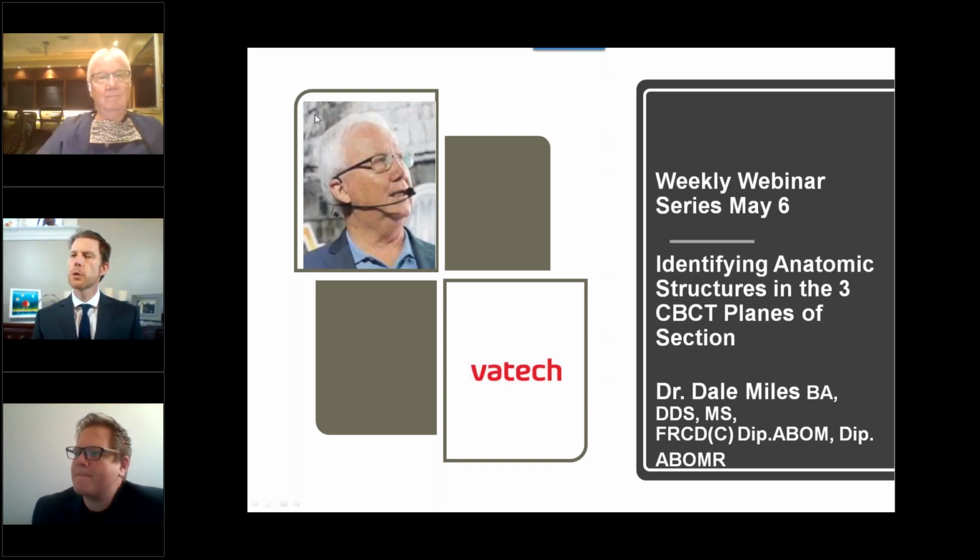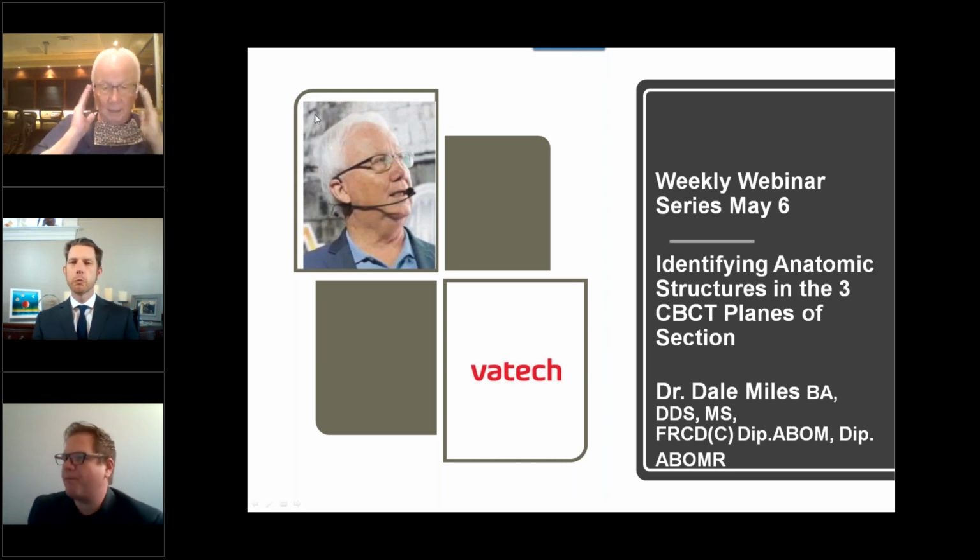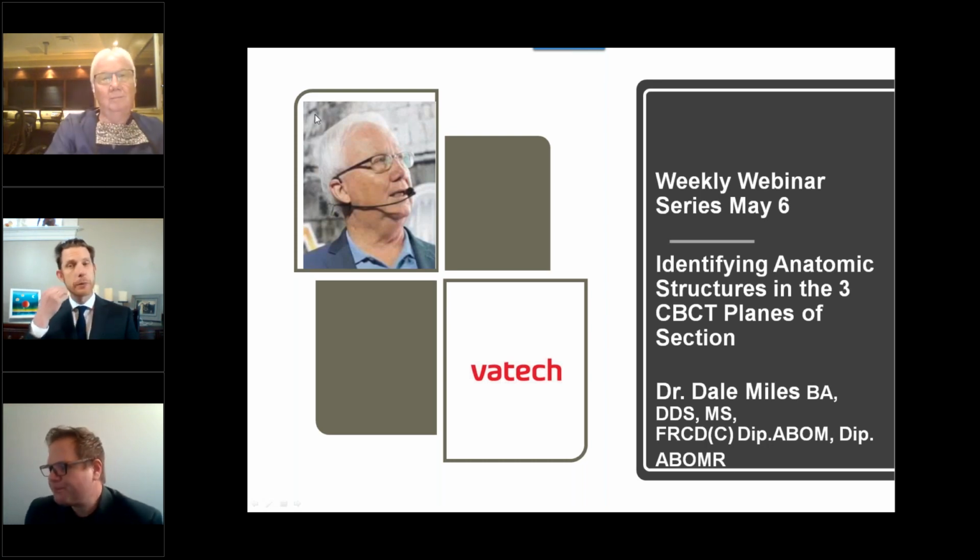Yeah, well, I think we had one last question about patient movement, doctor, and what to do if the patient moves. I know that greatly affects the image quality or the result of the image. And sometimes we get images that the doctor asks, hey, can you help me trace a nerve or look at this, and it's impossible. So we work with our staff members to identify, hey, this patient moved. We watch the patient when we scan them. What are your thoughts on patient movement? Do we just have to scan them again?